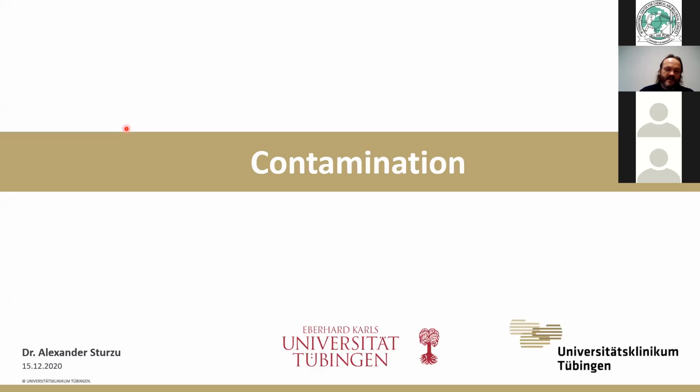The experience in my lab, not from me personally, but from a colleague, is that she happened to forget that she was working with the cells and trypsinized the cells overnight, and she could still recover some cells. This was way back when I was doing my master thesis. So yes, in an intact cell culture, the trypsin should not be any danger for the cells.